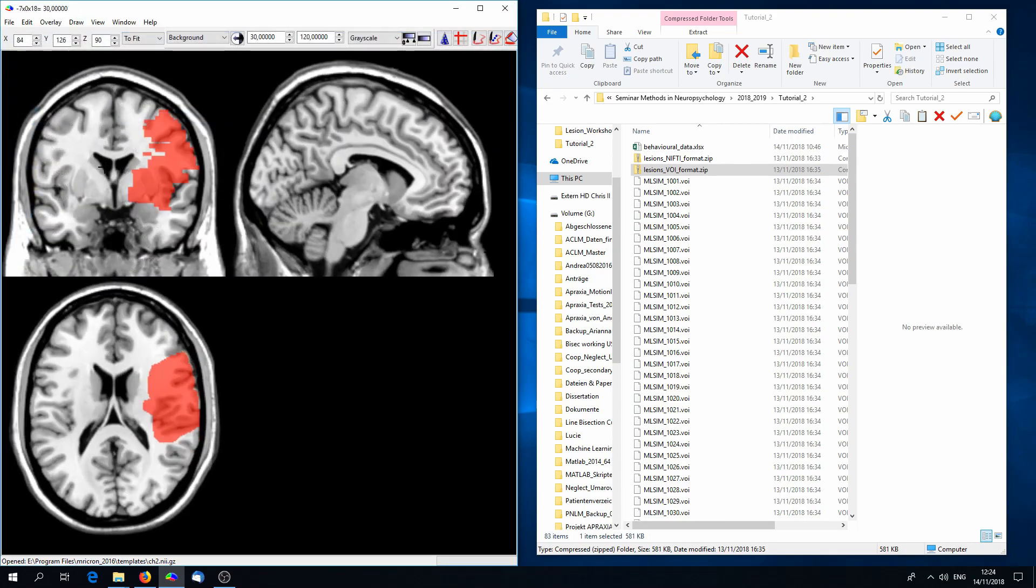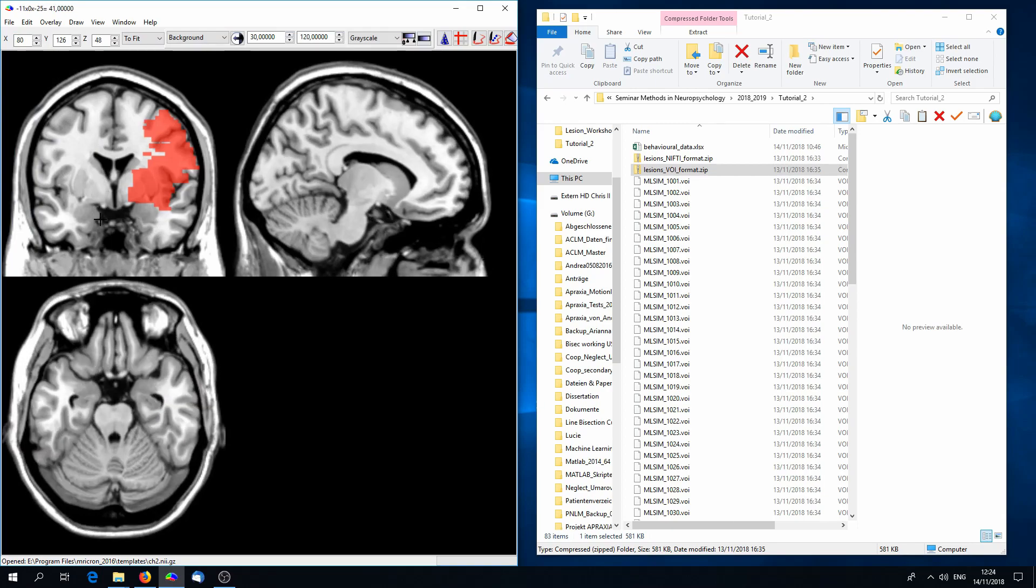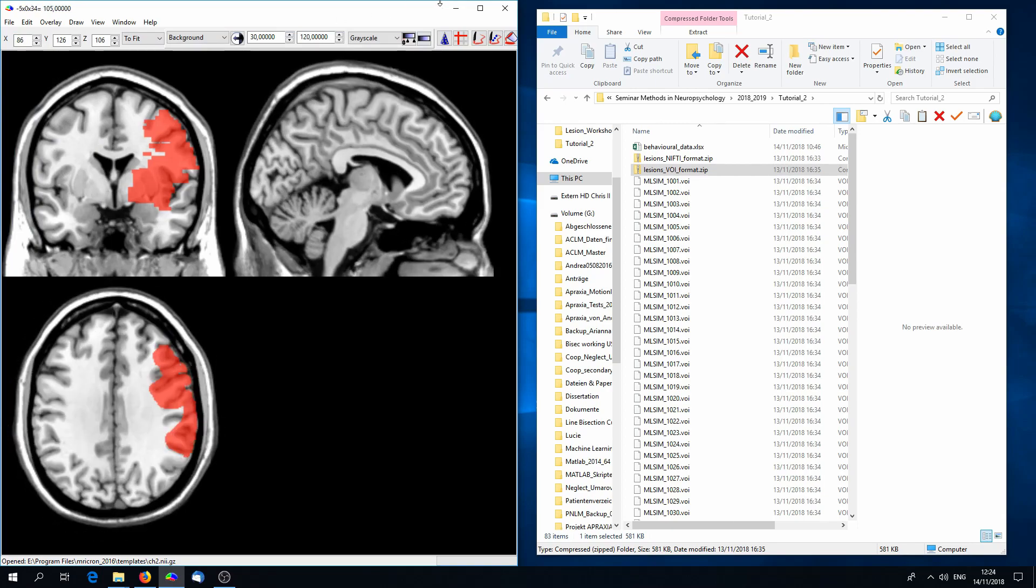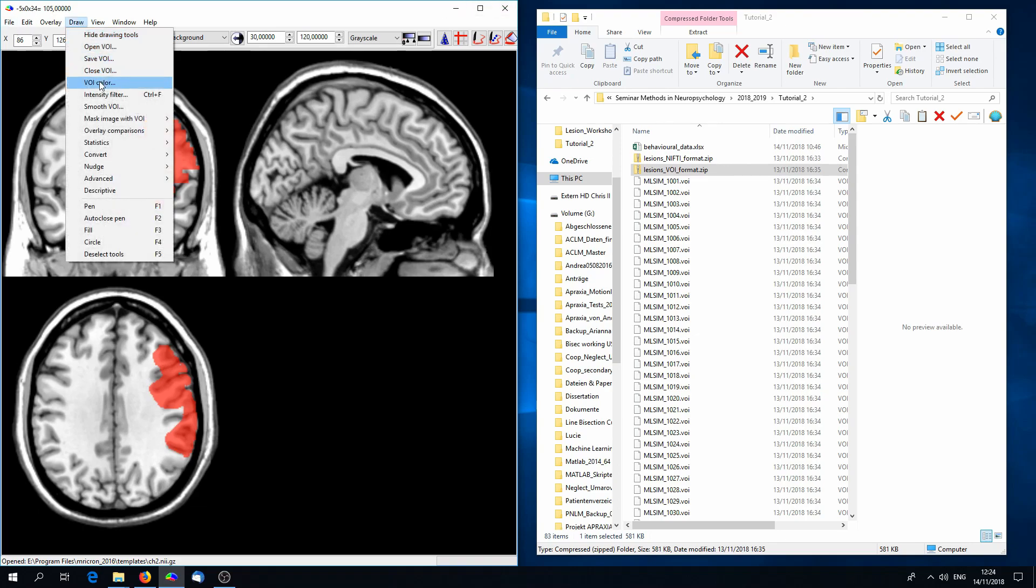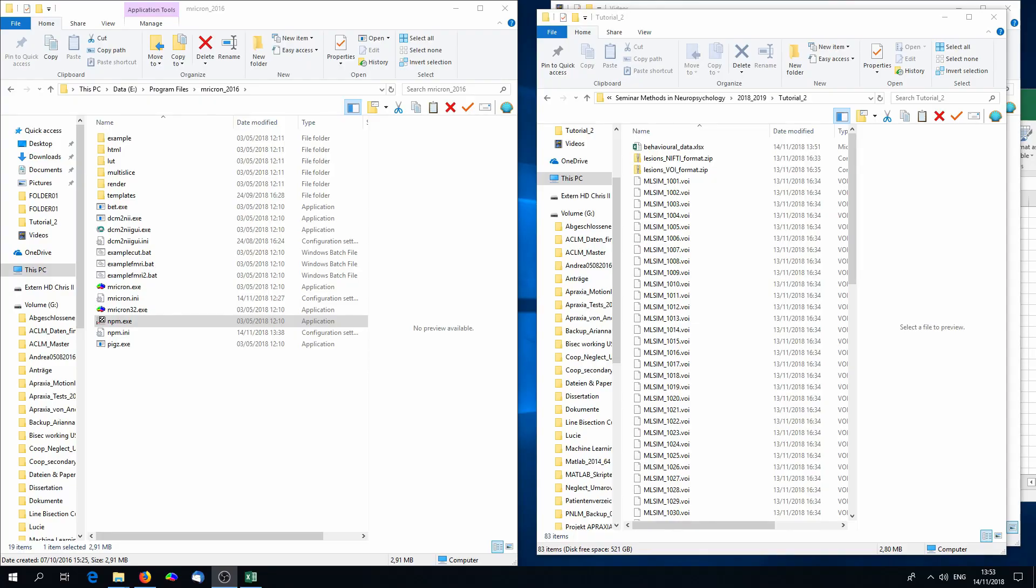The important thing is these images have been normalized to standard space, here MNI space, and they are binary, so either a voxel is red or not red, lesion or not lesion. This is what we need for the lesion analysis.